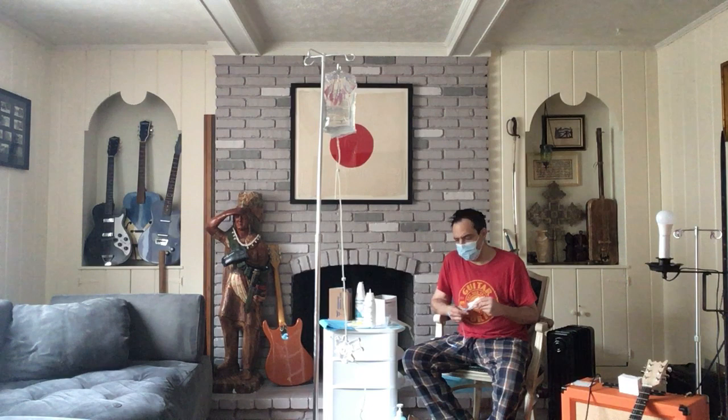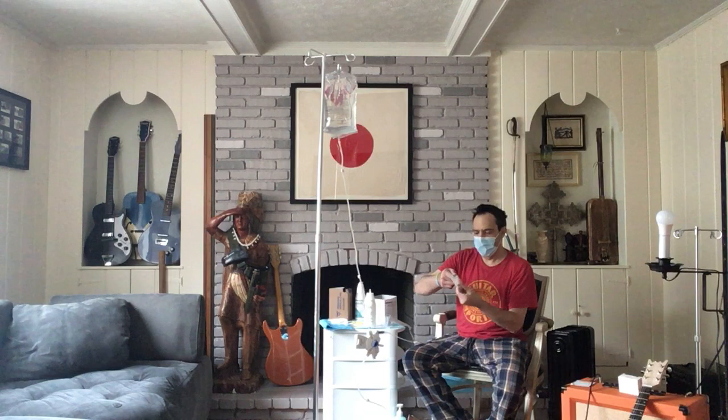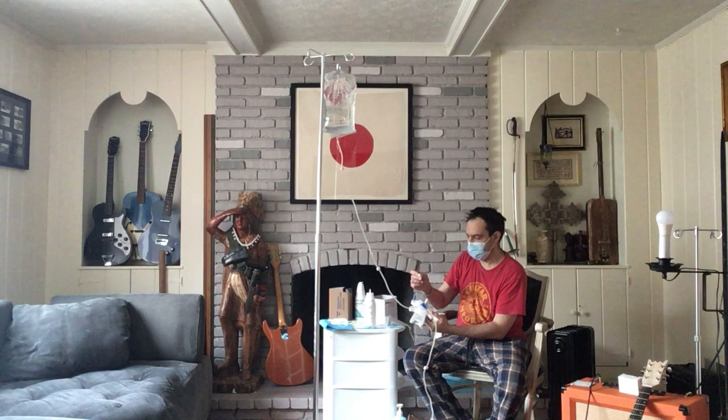All right, we're gonna put that into the extension. We're going to open our safety cap so that the side we grab is the white side. Pull it out. It has betadine inside of it. Betadine is a fancier form of iodine. It sterilizes.